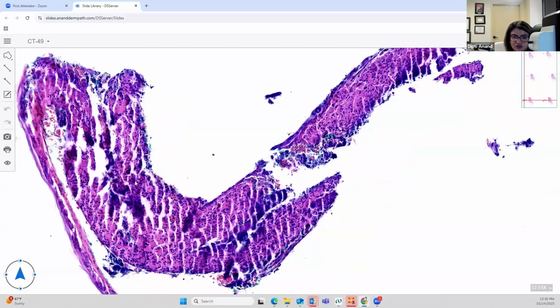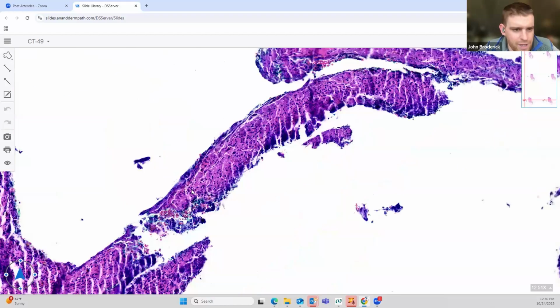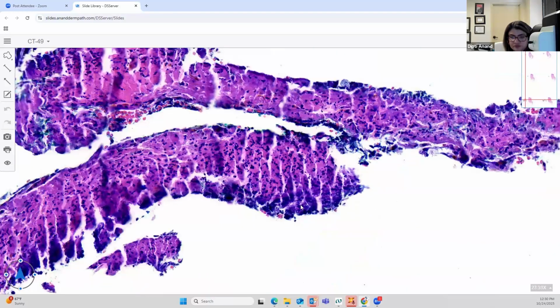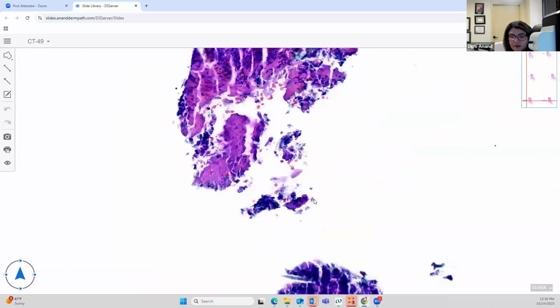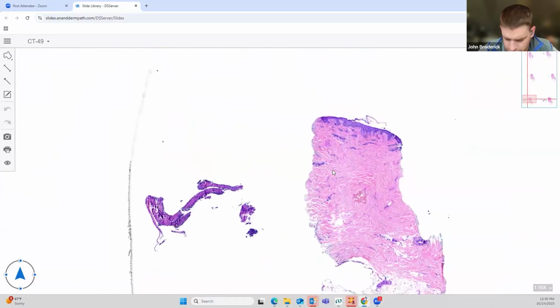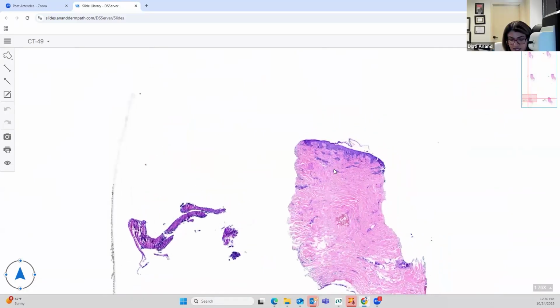So it's pretty cell rich, actually, right? It looks like neutrophils though, and looks like a lot of bacteria. Exactly. So the answer is bullous impetigo, and Keflex is the answer.